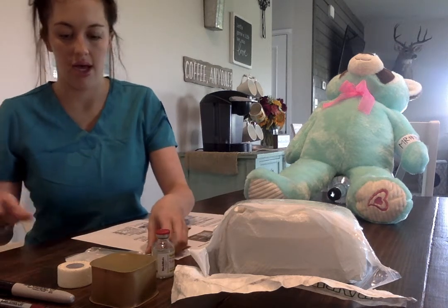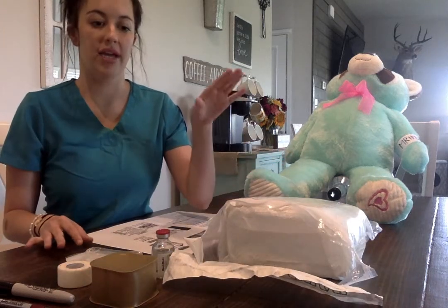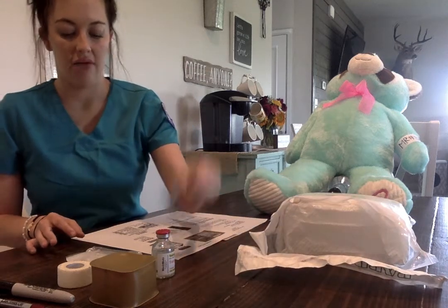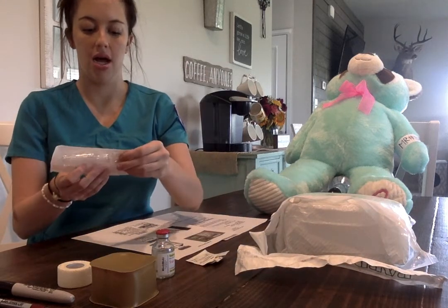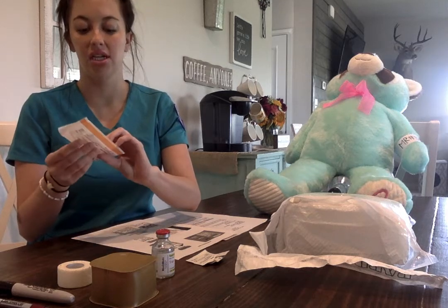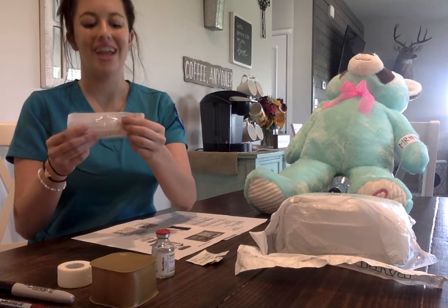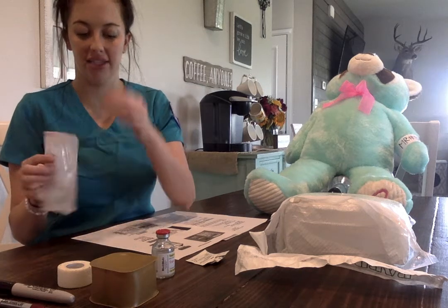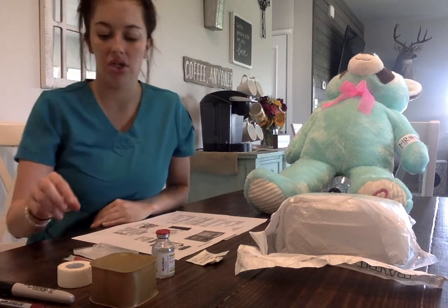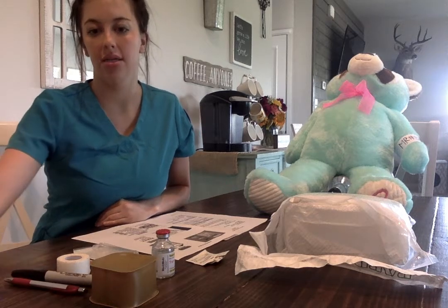Okay, and I have all my supplies. Also, I am giving him a foley catheter, so I went ahead and grabbed that already. I have alcohol pads, a 3 milliliter syringe with a 25 gauge needle, 5/8 inch in length, a blunt tip to draw it up, tape, and all my supplies.